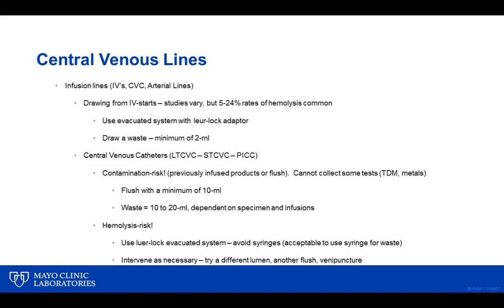Central venous lines, this is one in which I know there's a lot of variances. Perhaps in your institution, in the hospital areas, phlebotomists might not even be present. Here at Mayo, we have phlebotomy present during the central line collection. The nurse does indeed do the actual collection.